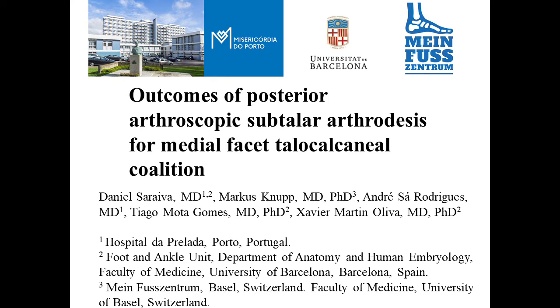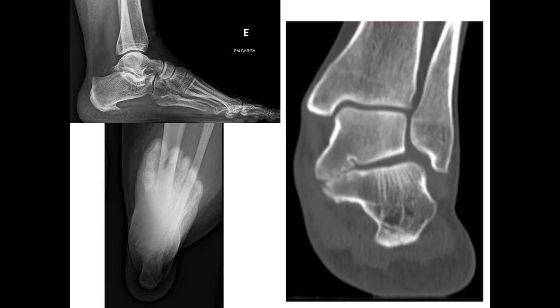This is a video on outcomes of posterior arthroscopic subtalar arthrodesis for middle facet talocalcanal coalition. This is an example of one of our patients, a left foot. A middle facet talocalcanal coalition is clearly visible in the CT scan.